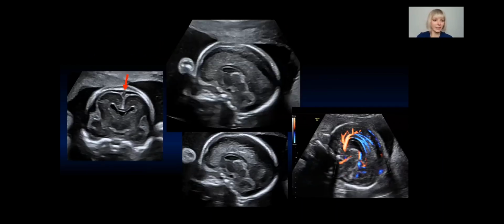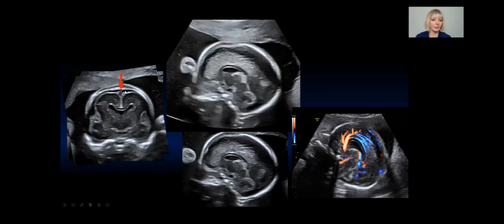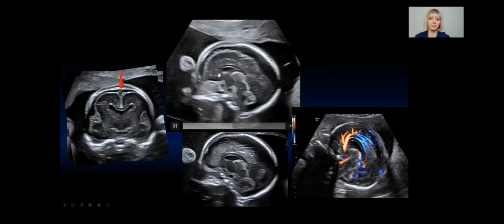If you are scanning, the ideal thing to do is to rotate your probe so that you have the probe absolutely parallel to the beam. Then if you twist the probe by 90 degrees, you will get a perfect midline sagittal view. And you can see one here. The bright white flash that you're seeing, which outlines the corpus callosum, is the falx. It is thin like a sheet of paper, and so it's actually very briefly seen as you go from side to side.